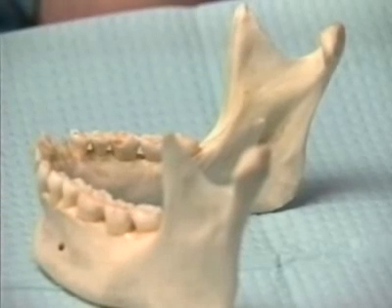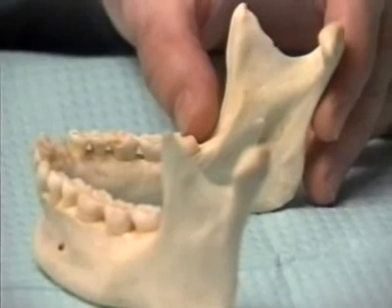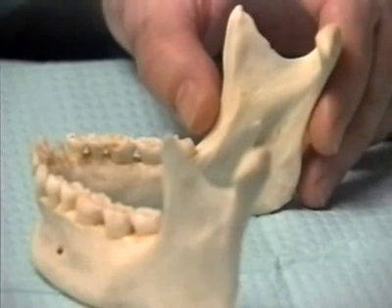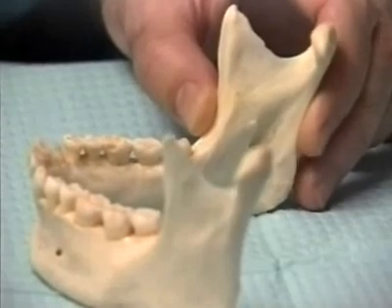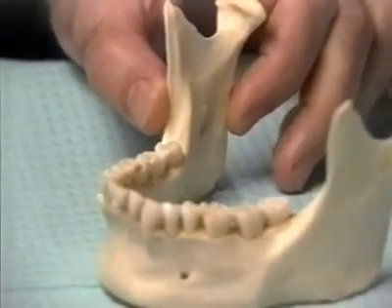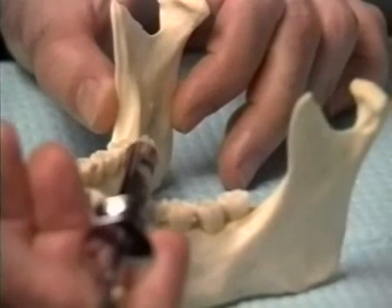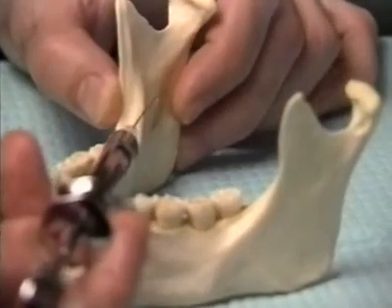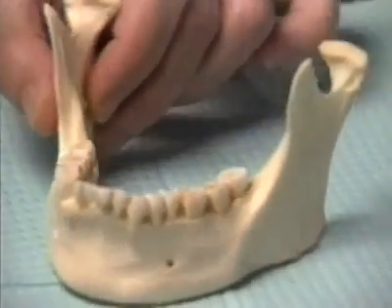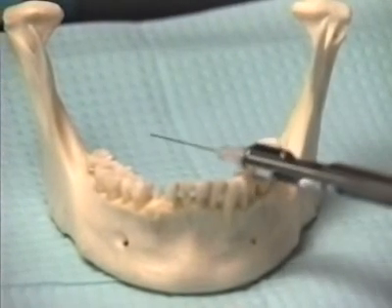Intraoral landmarks are key to this injection technique. The height of the injection is established by the greatest depression of the coronoid notch, a concavity on the anterior lateral border of the ramus. With the syringe held parallel to the mandibular occlusal plane and at the level of the coronoid notch, the needle will be in a plane that intersects the mandibular sulcus. Because of the lateral flare of the ramus, the syringe must be advanced from the contralateral premolar region for the needle to enter the sulcus.